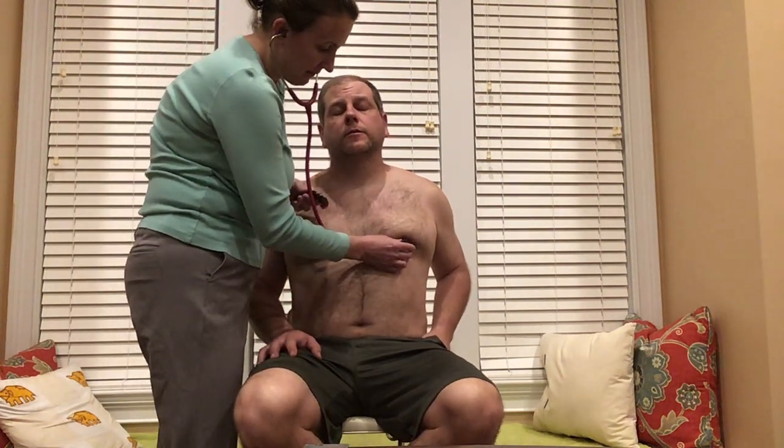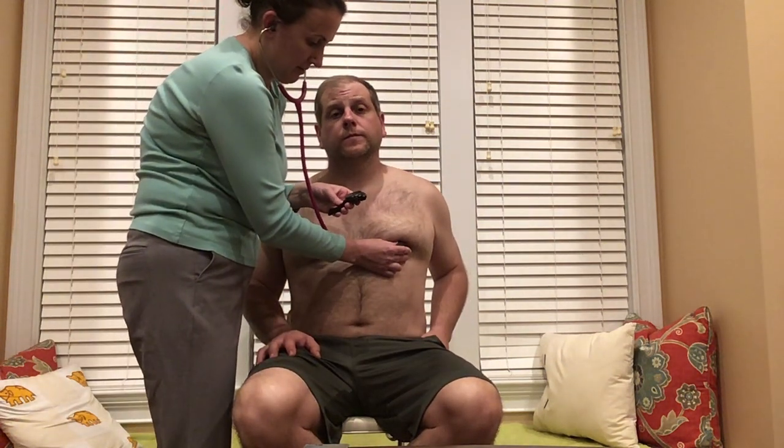I'm going to auscultate the heart fields, the aortic valve, which is second intercostal space, right sternal border. Pulmonic, second intercostal space, left sternal border. Erb's point, third intercostal space, left sternal border. Tricuspid, fourth intercostal space, left sternal border. And the mitral or apical, which is also the point of maximal impulse, fifth intercostal space, mid-clavicular line. And I will auscultate for 1 minute.